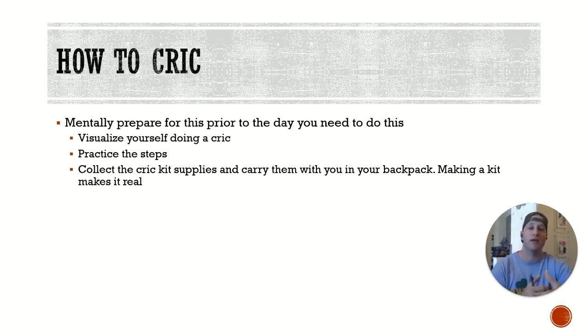You need to generate a way that makes it real for you. A way that makes it real for a lot of people is get a cric kit. Get a kit that has the supplies. Open it up. It's all good if it's not sterile. You're saving their life. It doesn't matter. The airway's not sterile anyway. Keep the cric kit with you. Get familiar with it. That makes it real.